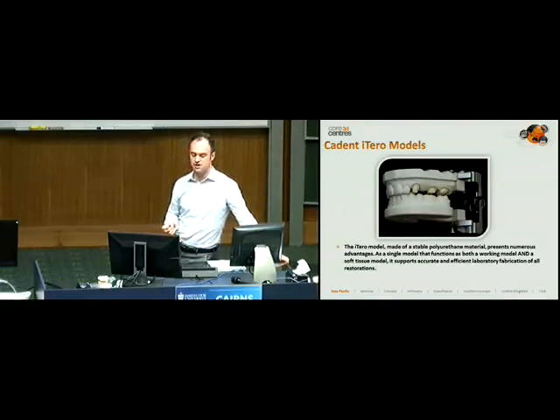it's called G-code generation. For the mill to mill the detail on each individual tooth, it would take a couple of days to mill a quality model. So what the software does is wash it out a little bit in the areas it doesn't need. So you get this slight washed out look, and people often mistake that for inaccuracy. It's really not. It's been done on purpose to speed up the milling time. But in and around the preparations and the removable dies, it's extremely accurate.